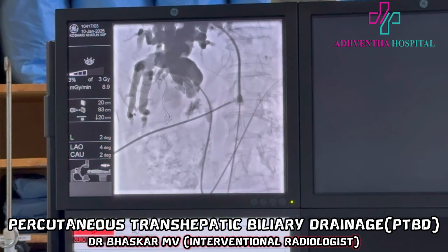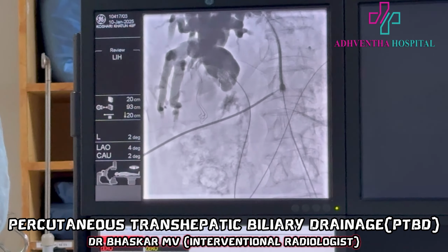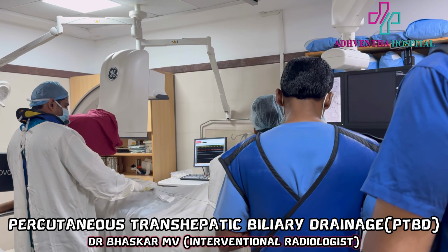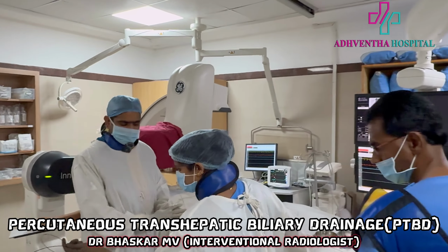In fact, that is one of the confirmations that it will be there in the duodenum. Sometimes what happens, if the mass is very friable, the wire may enter into the peritoneum. So that's why you have to confirm where exactly, because it is a mass we have crossed. It was very stiff, we crossed it.